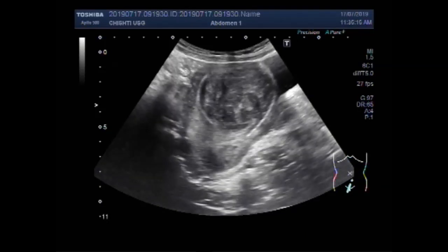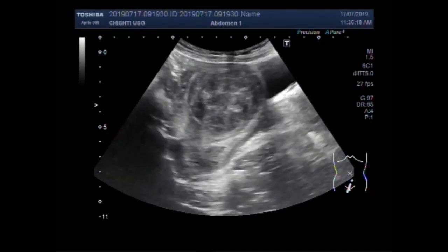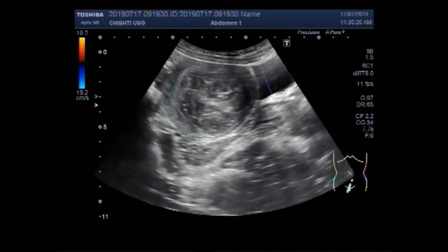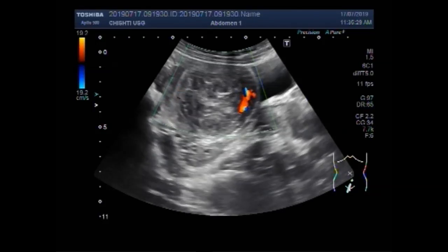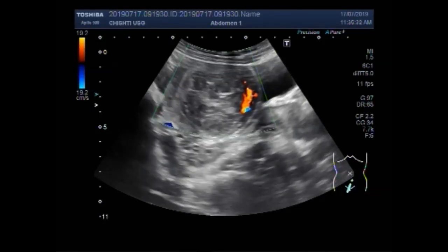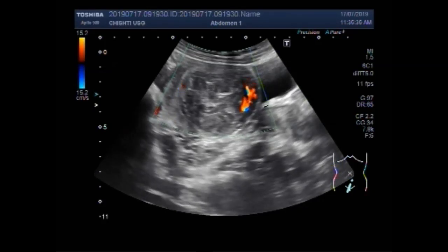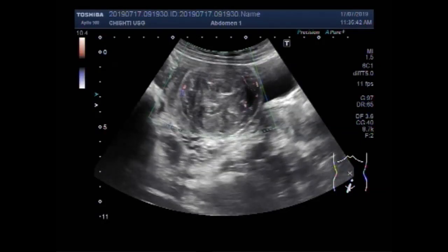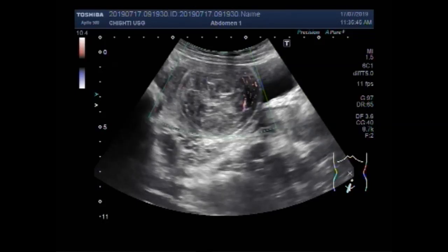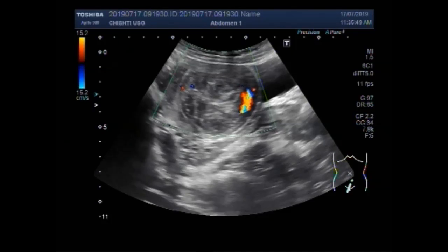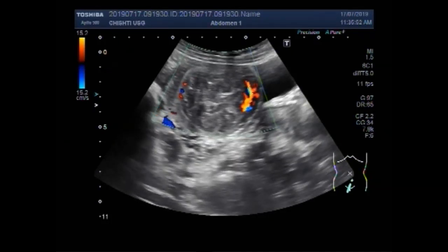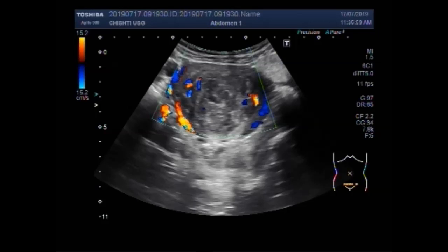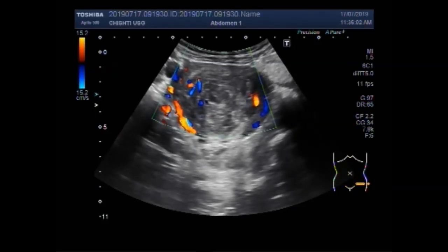You can see this mass is semi-solid to solid in consistency, round to oval in shape, and has heterogeneous echogenicity. Now you can see the blood flow in this mass. Quite a significant blood flow is seen, especially in the uterus. This mass lies in the middle and distal portion of the uterus, and only the proximal portion is spared.